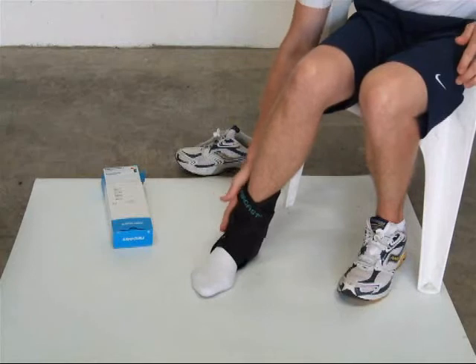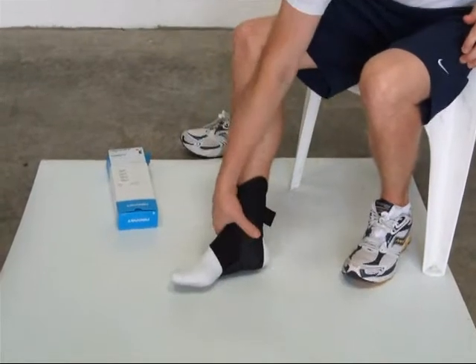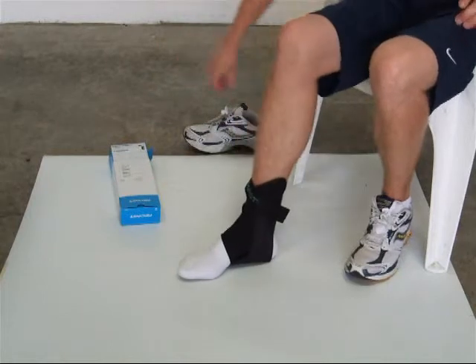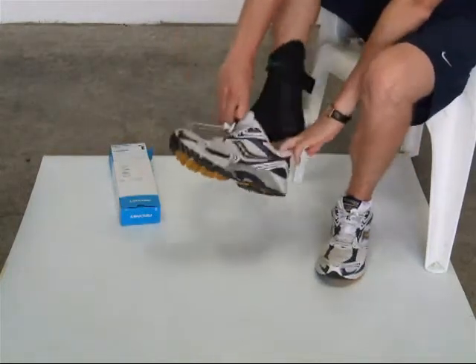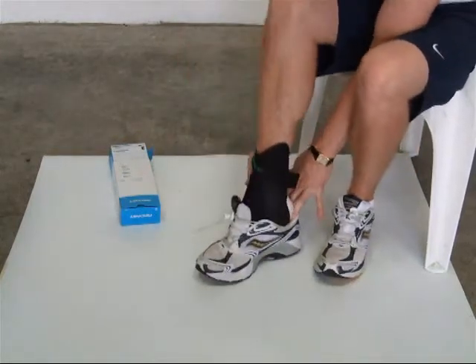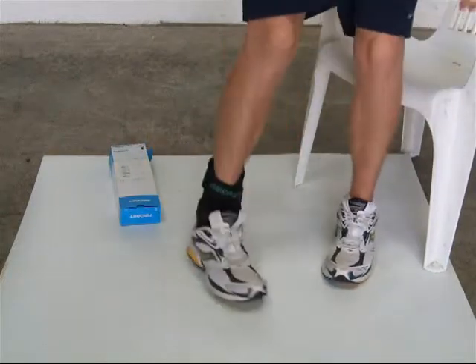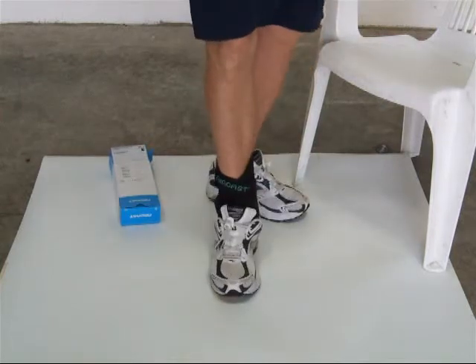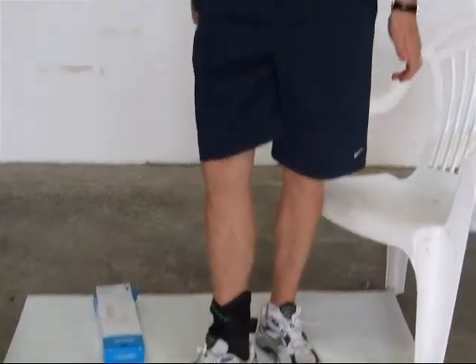It is a slightly bulkier brace; however, this offers more support to your ankle. It will still fit into your trainer — it is slightly bulkier but incredibly comfortable. So that's the Aircast Air Sport Ankle Brace.